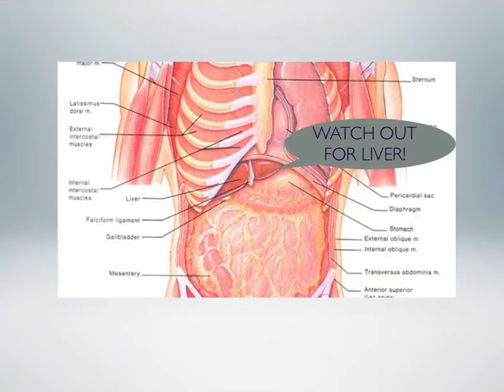For me, I prefer to go parasternal in one particular circumstance, and that's where there is no backup, or perhaps another circumstance where I'm worried about bleeding. So backup is typically available in U.S. hospitals. We're not in Tamale, Africa. But the bleeding issue is the big one in the U.S.